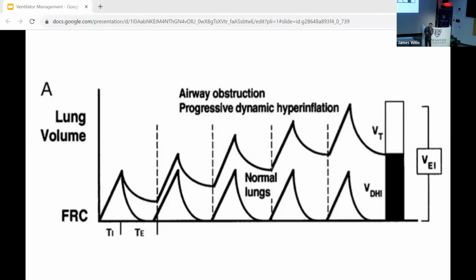You arrive at the patient in the CCT room 5, the ventilator's alarming, he's bradying down, blood pressure is starting to go down. What should you do when you think it's auto PEEP? Anybody? I see a lot of hand motions. Everyone's doing an interpretive dance. Disconnect the ventilator, I think is what I'm getting, and press down on the patient, help them exhale, reconnect them, but don't reconnect them at the same ventilator settings. You have to make an adjustment because it's going to happen again.